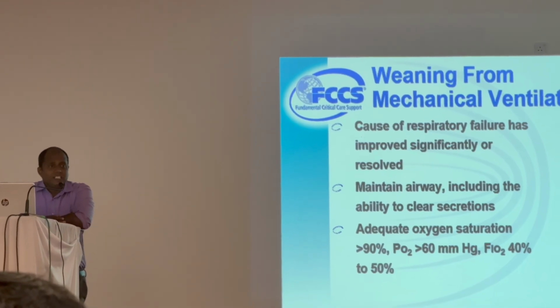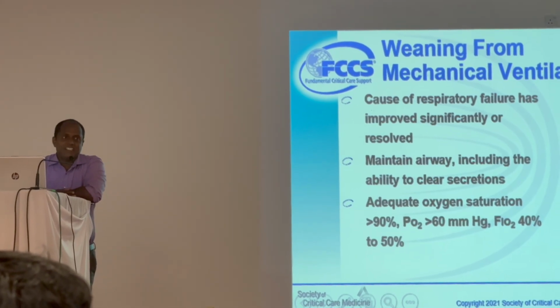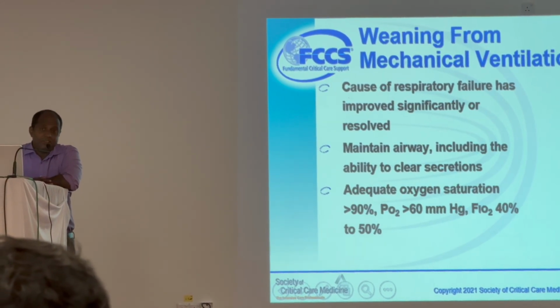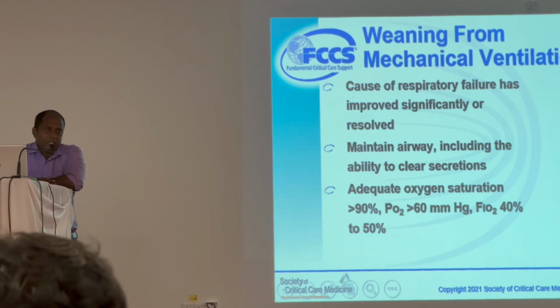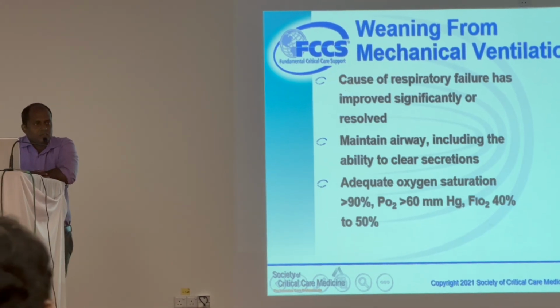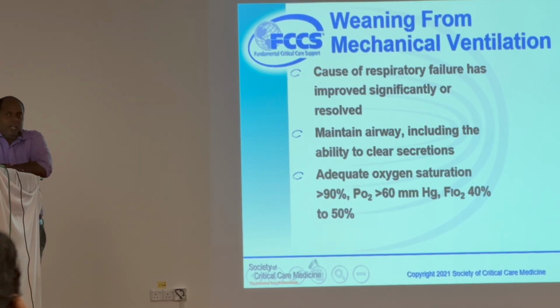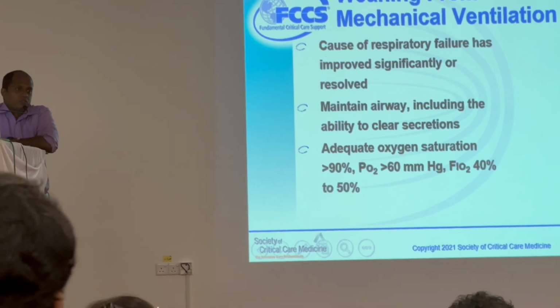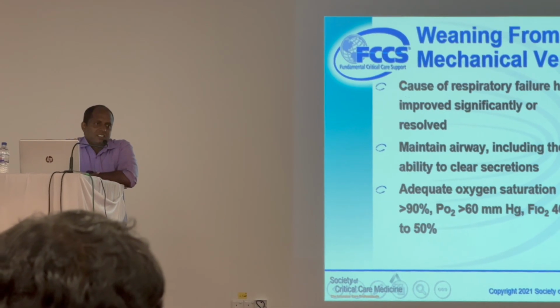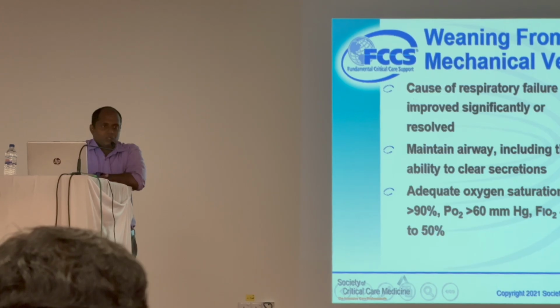So when we decide for weaning the kid, if we think the kid can tolerate on his own feet, we can wean. So when the weaning starts, about mechanical ventilation, when the weaning starts, anyone? This is a very important question. Most of the time I have asked the question in several forums. Weaning starts at the time of intubation.